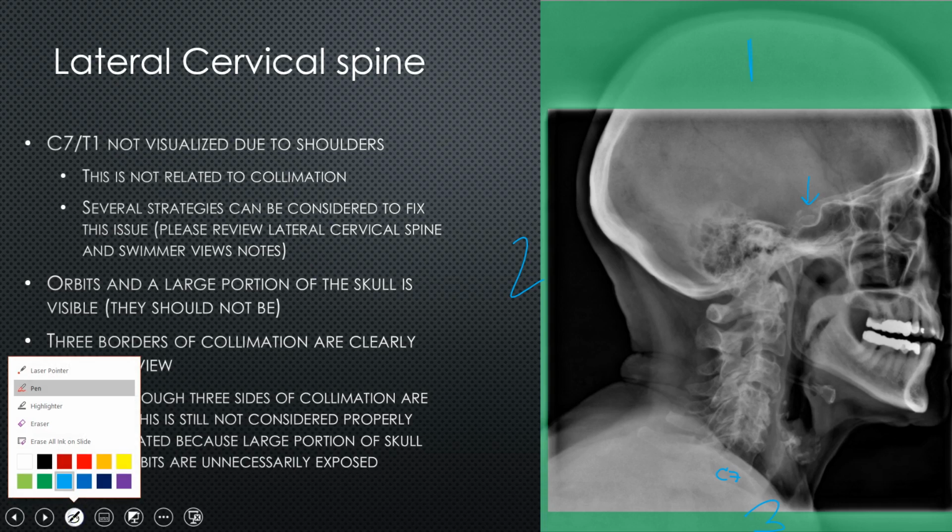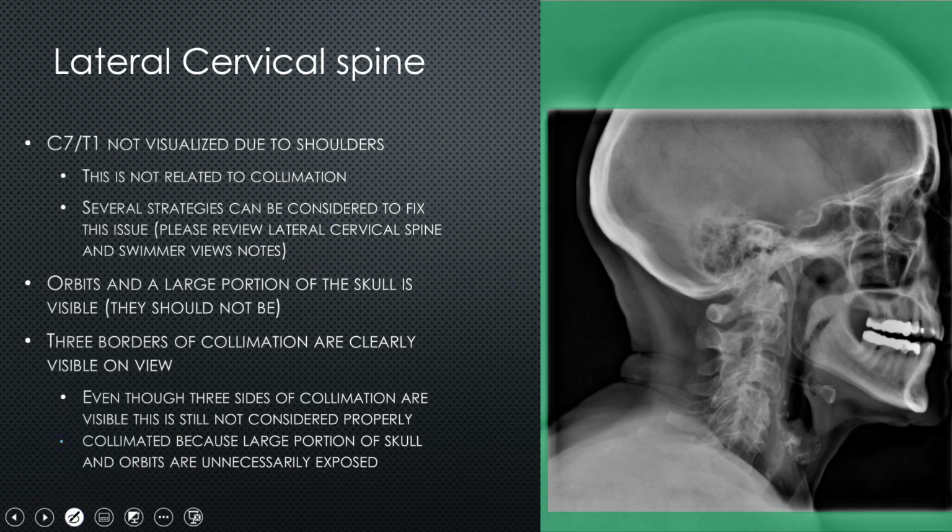However, again, we have to make sure that the patient's eyes aren't getting any of that radiation dose as best as we can get it. So a proper collimation would be if we were to cut it there, just to make sure that their eyes are safe.